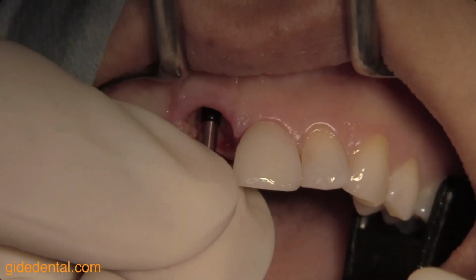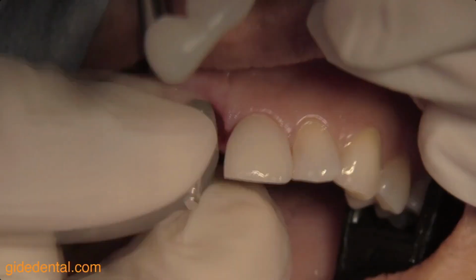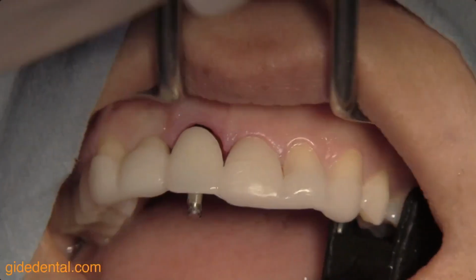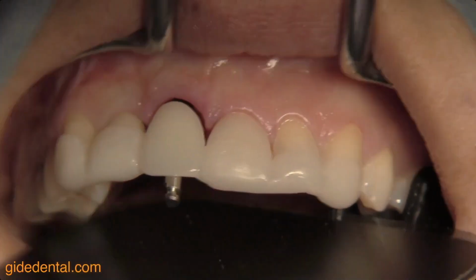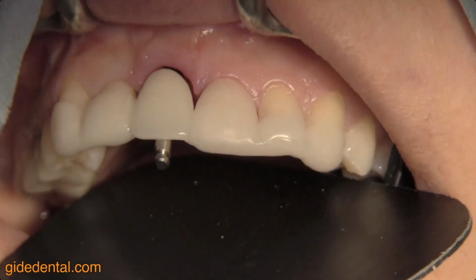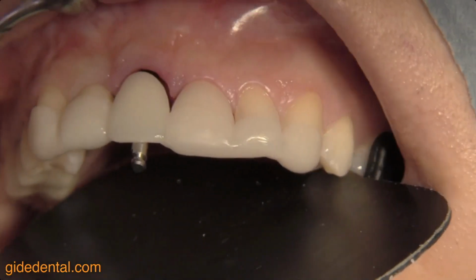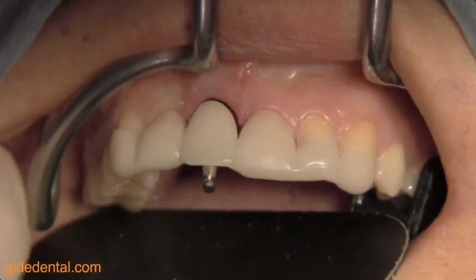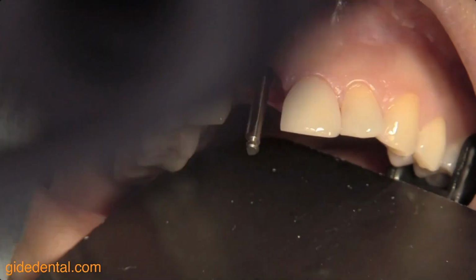It's a 3.5 millimeter implant that we're planning. So the last drill is probably going to be somewhere around maximum, I would say, 3 millimeters. So we have a little expansion. But I probably would go, if the bone is soft, maybe go maximum 2.8. So we have a 0.7 millimeter expansion into the bone.